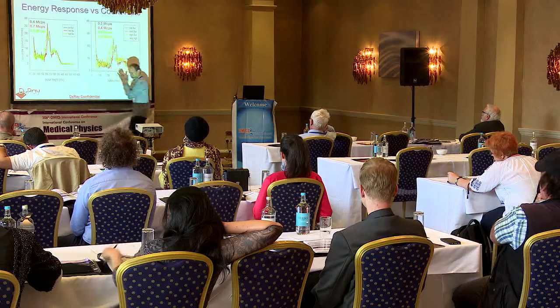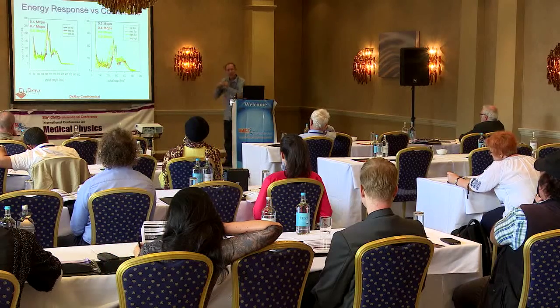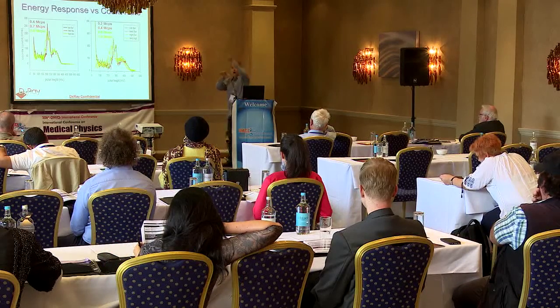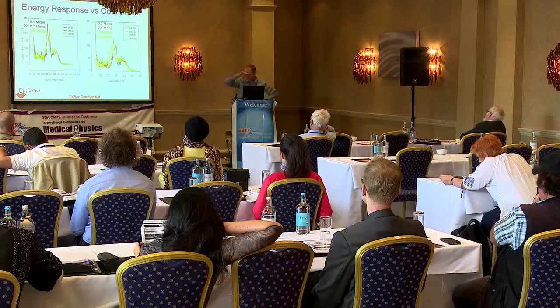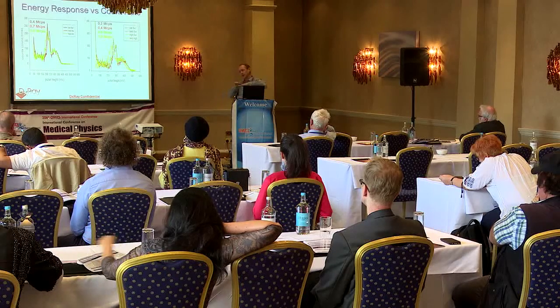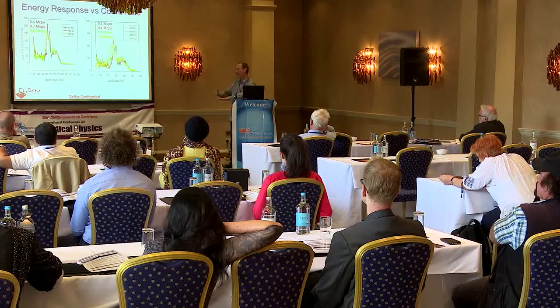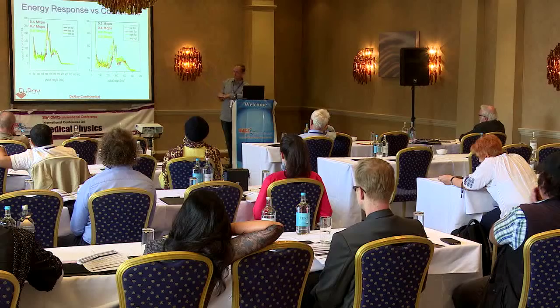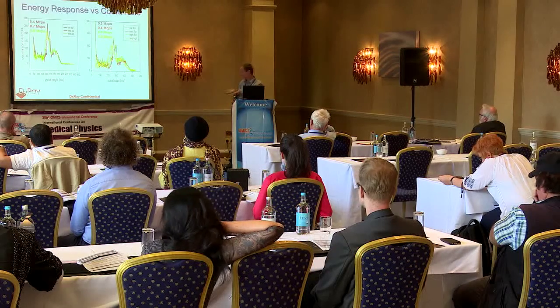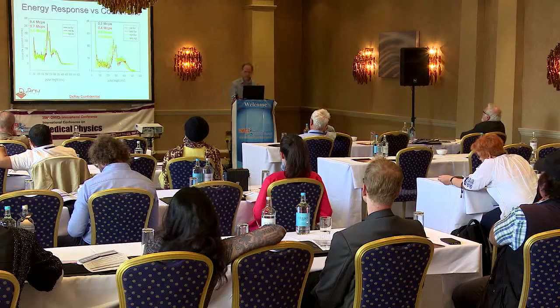Now, the reason there's a shift to lower energy here is it's not because of pileup, it's because of the use of a bipolar pulse shape. And so with a bipolar pulse shape, which is better in this technology, at very, very high count rates, the baseline can be dragged down, and all of the energy bins are measuring the energy of that pulse height relative to that baseline. So as the flux gets really, really high, the baseline starts to shift down.